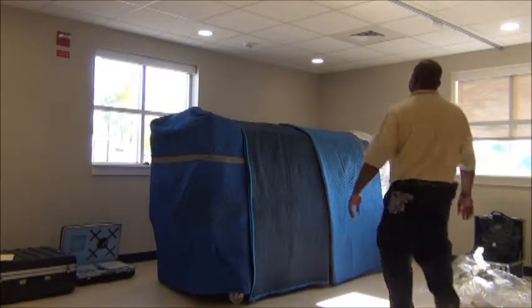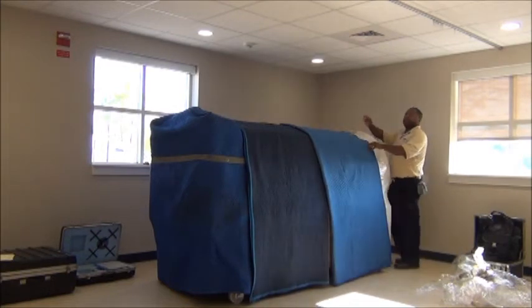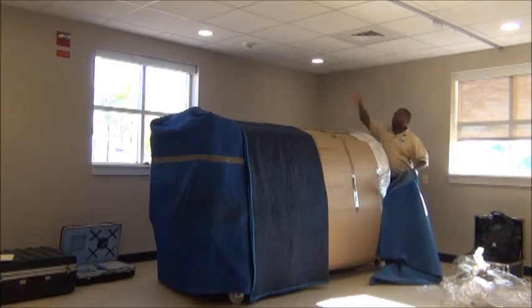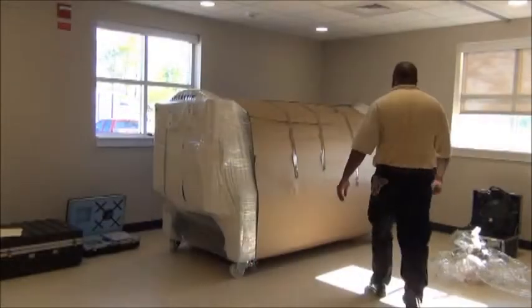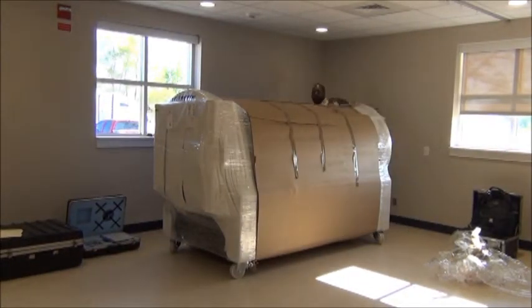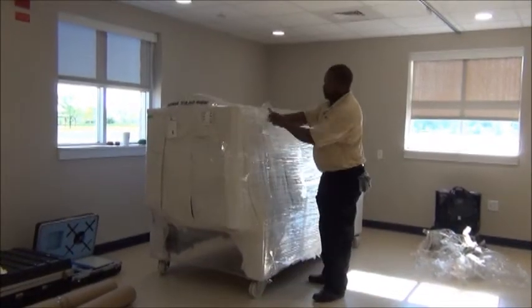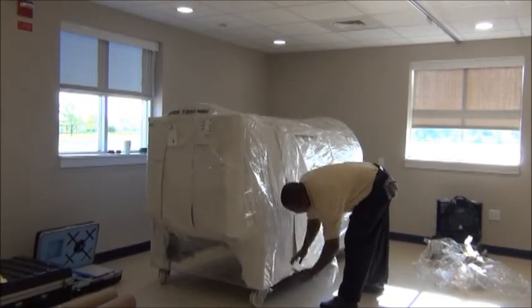And if you do become oxygen toxic, then you have a seizure. And the rate of seizures is very, very slim. So it's not, oh my goodness, I'm going to go in here and I'm going to become toxic. Very, very few people experience that. And the result is a seizure, which is not usually life-threatening. Thus, hyperbaric chambers offer an array of healing opportunities with relatively low risk of mishap.